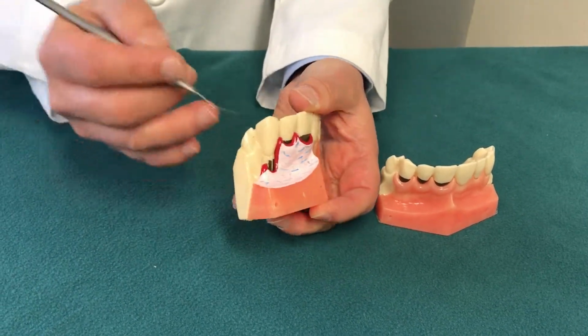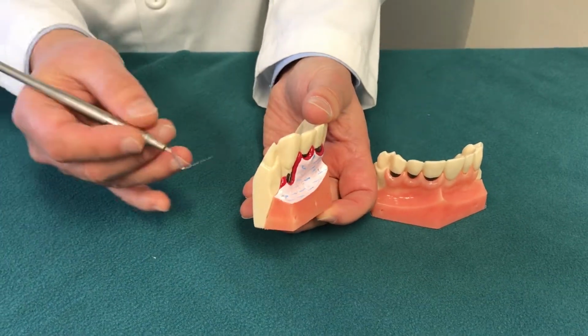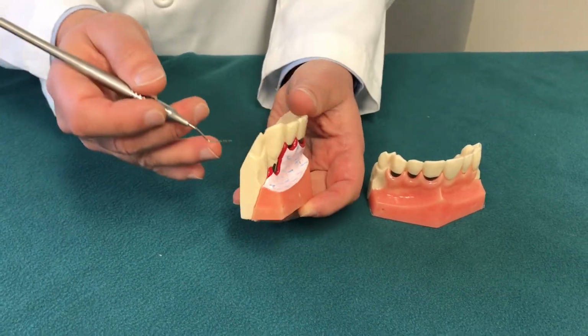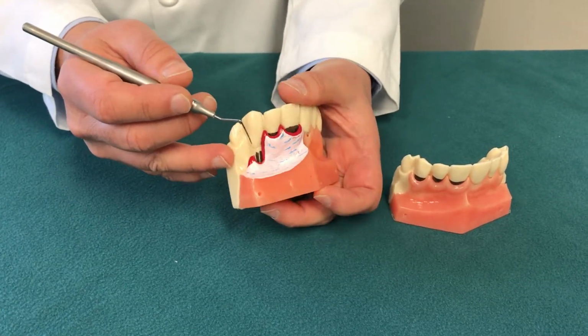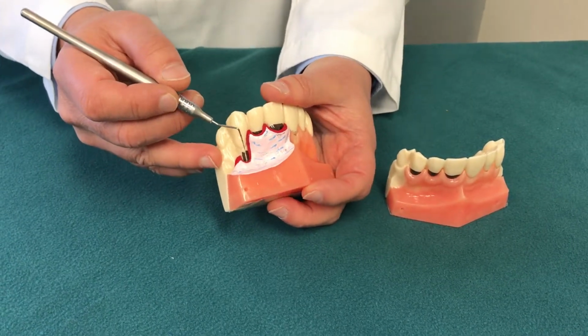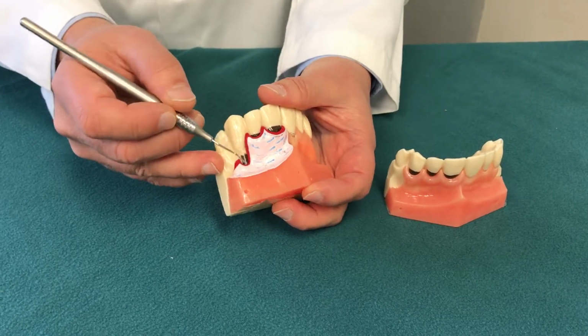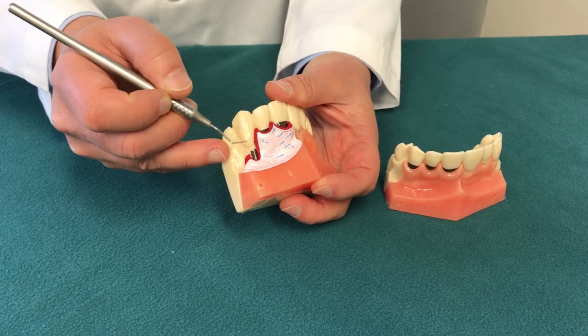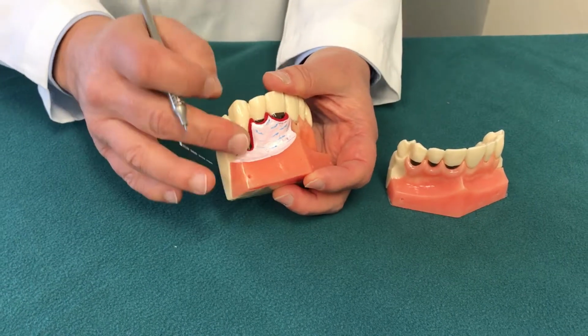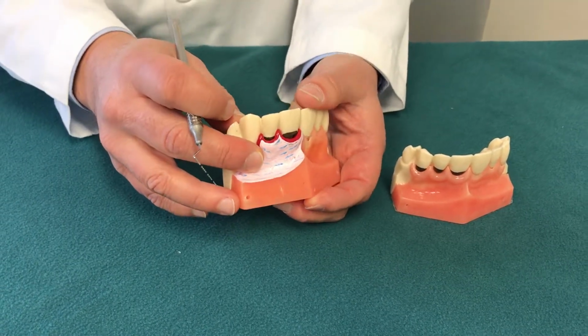Nowadays what I do, I go to the very last tooth and I take the tissue from there if possible, and that makes it not as sore at all, and patients don't even know about it. However, in this method, it's very difficult to bring the gum all the way to where it should be. This is called a free gingival graft.